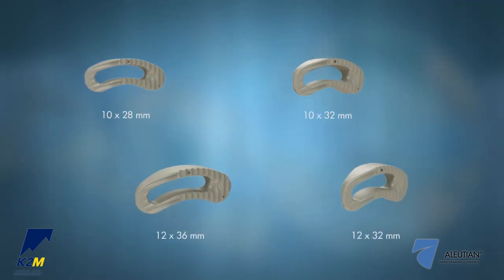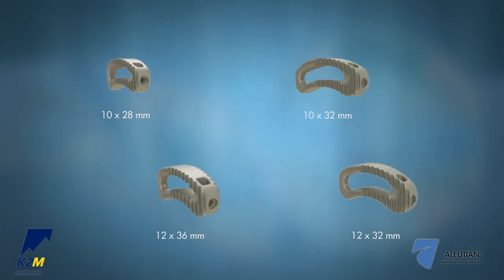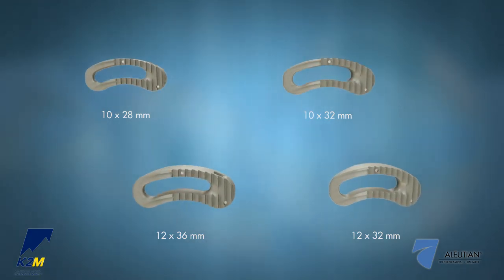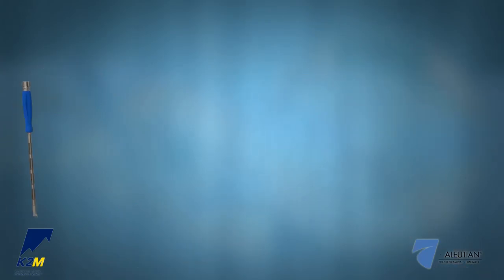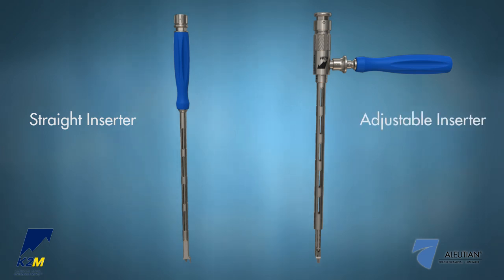Ellucian T-Lift II implants are available in four footprints with heights ranging from 7 to 15 mm in 1 mm increments. There are two inserter options for placing the implant: a straight inserter and an adjustable inserter, which allows for varying implant angulations.